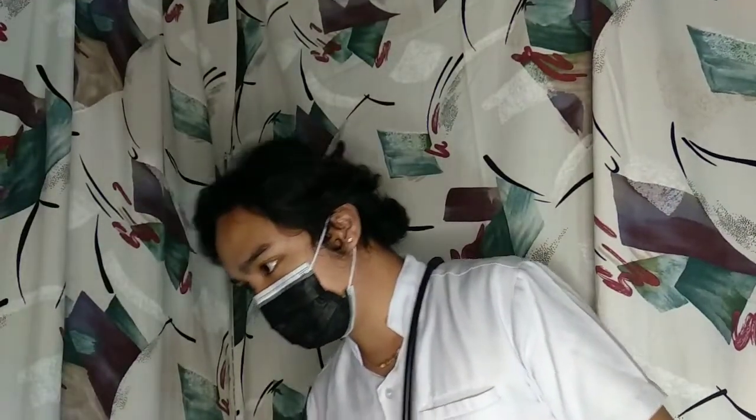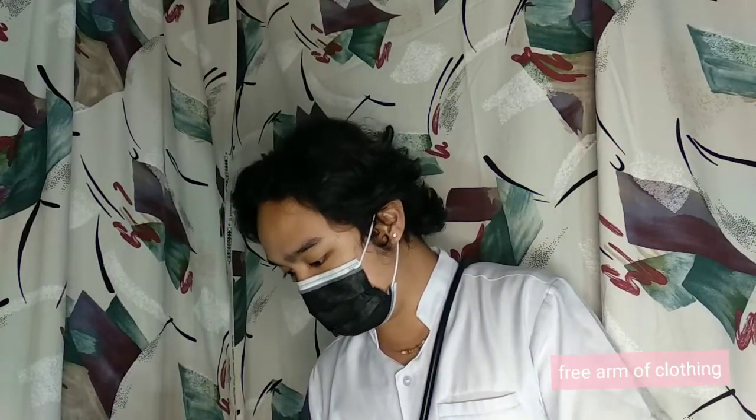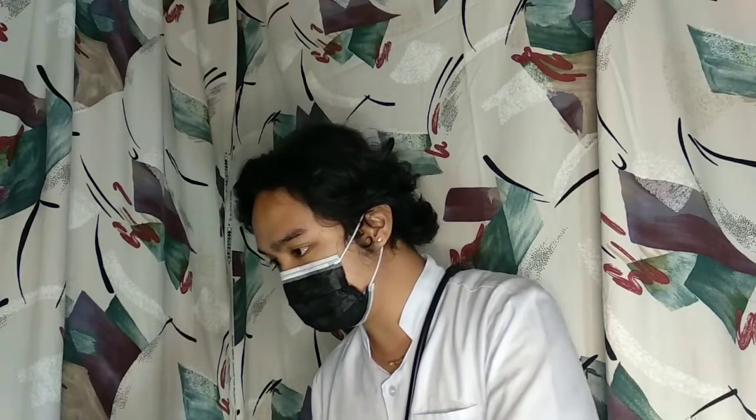Sir, may I also ask to free your upper arm from any clothing? Can I roll your shirt, your sleeves?